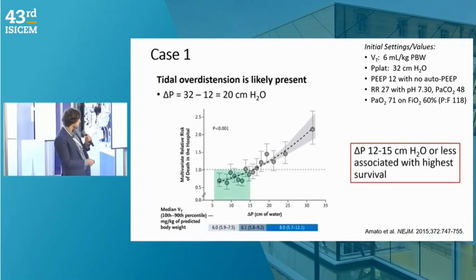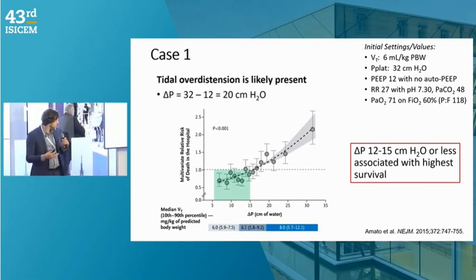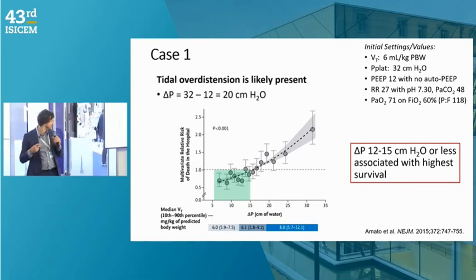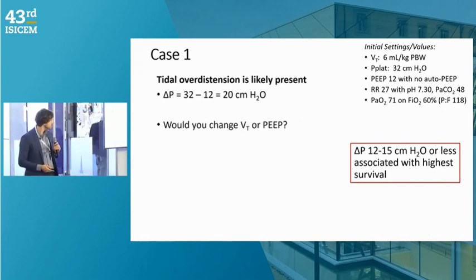This is just the story of driving pressure that I mentioned, and most people in the community, I think, refer to a driving pressure of somewhere between 12 to 15 as probably the upper limit. That's based in part on this analysis from one of your colleagues in Brazil. You're probably on this too. But similar papers using other data sets have suggested similarly that a driving pressure of somewhere between 12 to 15 is probably in the safer range, and certainly the curve seems to pick up quite substantially afterwards.